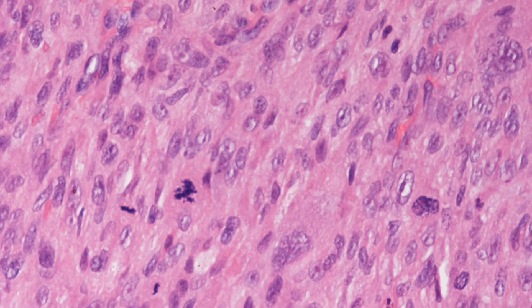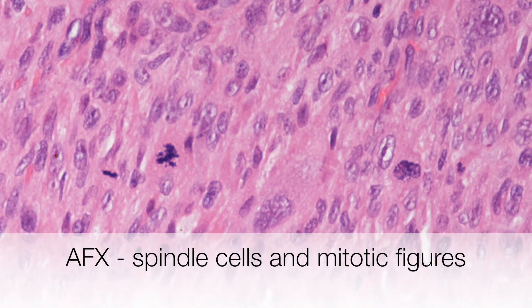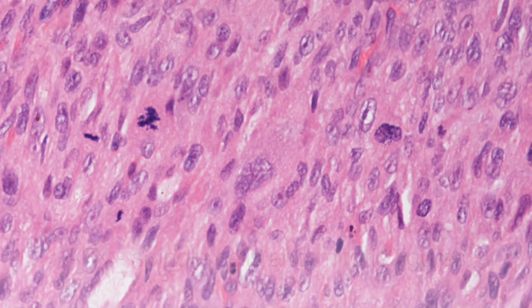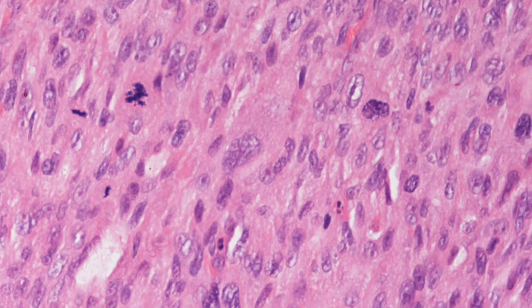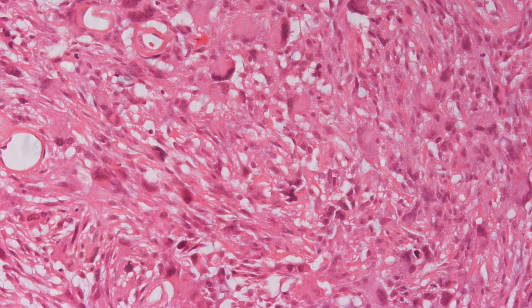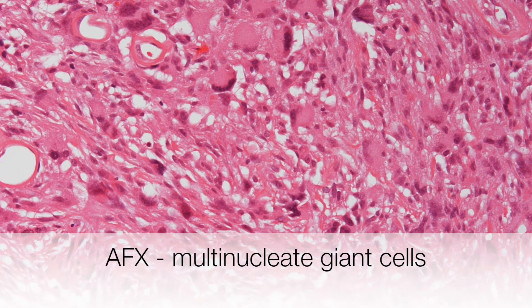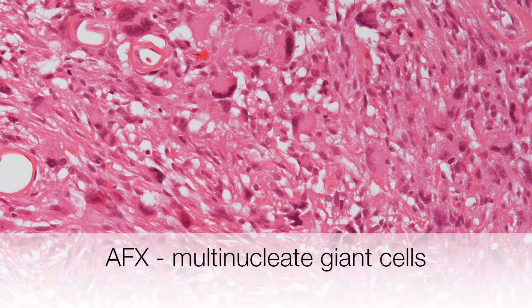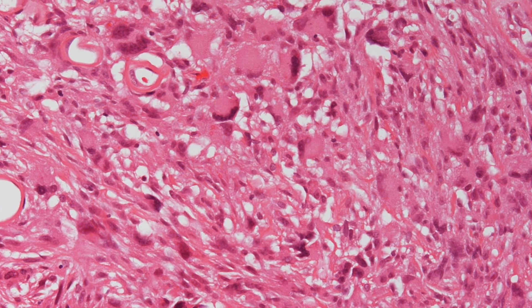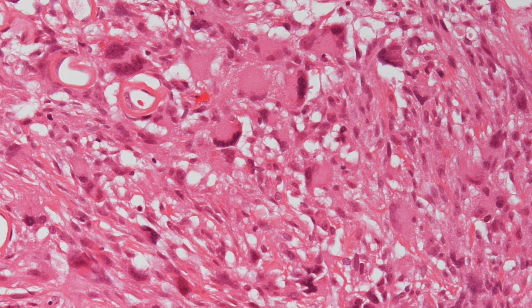On higher power, this part of the tumour shows lots of spindle-shaped cells with rather pleomorphic nuclei and quite frequent mitotic figures. And here the tumour looks cytologically horrid, again with a lot of nuclear pleomorphism and several multinucleate giant cells.